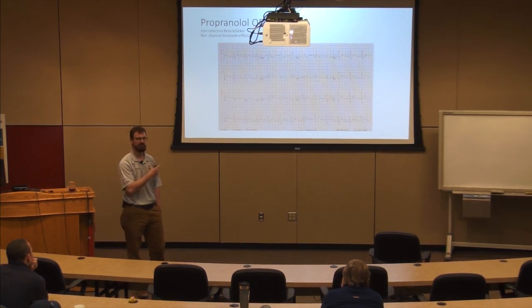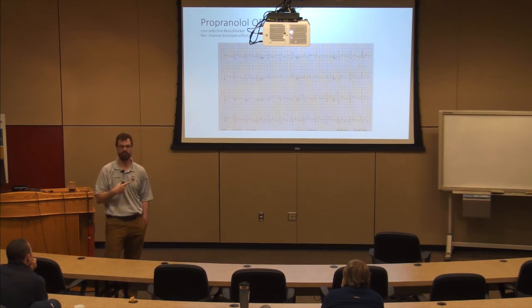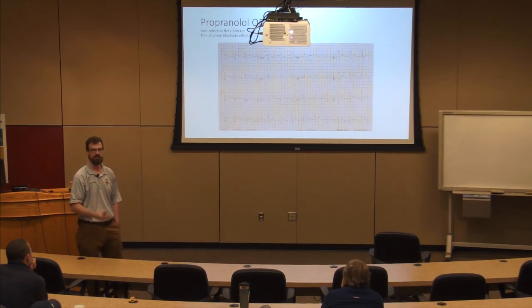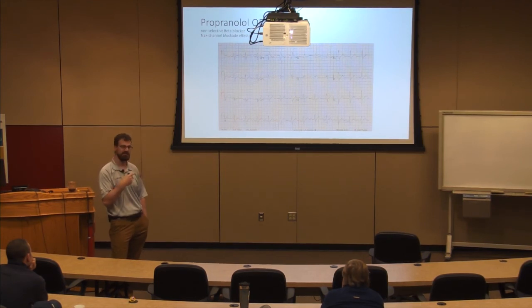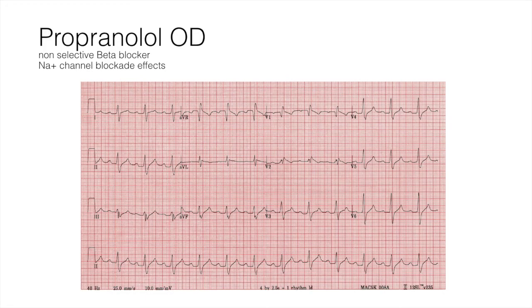So this is someone who's actually going to get admitted to the hospital on a tele bed and monitored before I can clear them to be evaluated by psychiatry. And she may be alert and annoying and whiny, and you feel like, hey, this is total BS, right? This is someone who's going to be at risk for arrhythmias. This is cardiotoxicity manifested on the EKG.